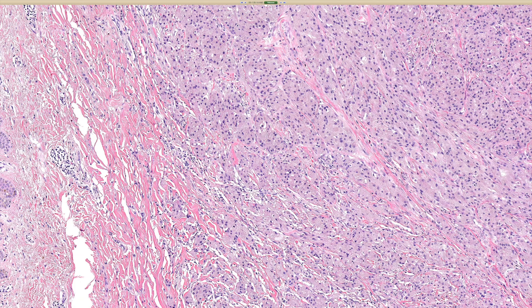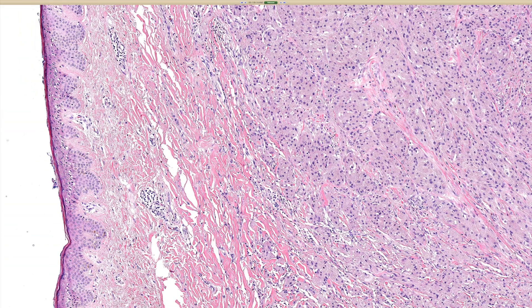CD68 is a marker that stains phagolysosomes. Histiocytes are abundant in phagolysosomes, but other cells can have them too — so any cell with a lot of phagolysosomes will probably label with CD68 immunostain. You really don't need to do that stain in this case, but the classic teaching for a test is that granular cell tumor is positive for S100, SOX10, and CD68. PAS will also beautifully stain these granules.